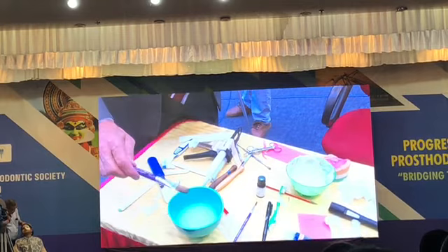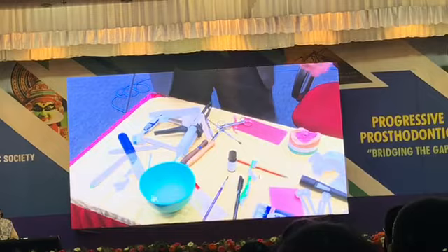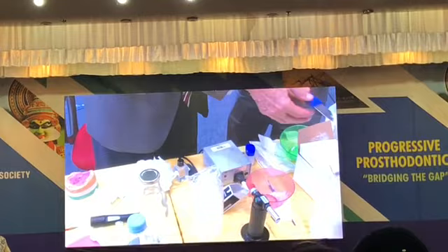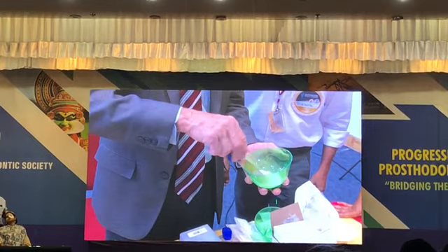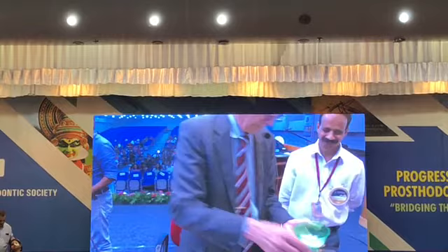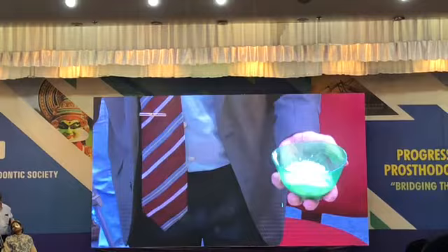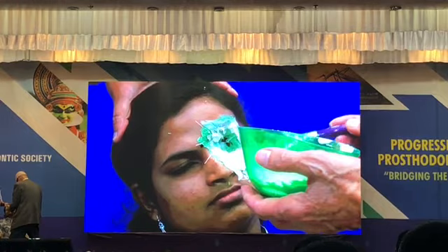Clean this bowl, somebody, because we're going to need it again. Okay, mix. Let me mix again, because I can mix it faster. Now I know how fast. You have to do everything on your own. You want to do maxillofacial, get your hands dirty. That's for sure. We can't delegate much of this stuff. You have a good assistant. I have a perfect assistant that knows exactly what I want. Okay, now this is just right. So now we just paint it.